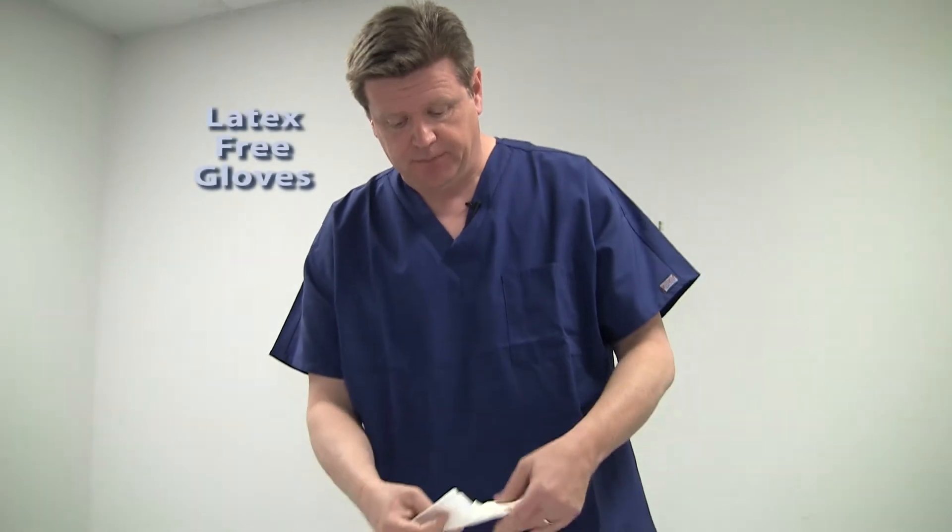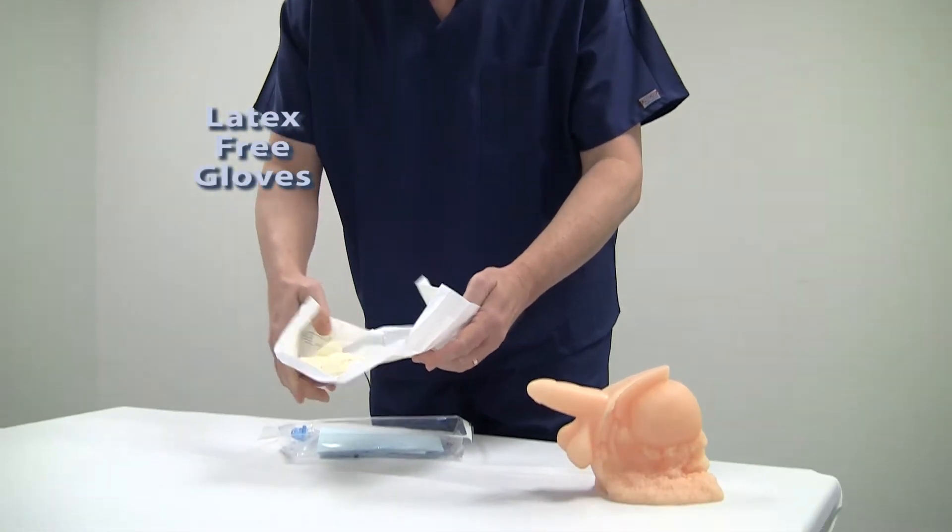First, I'm going to show a demonstration of how to catheterize the male patient. Before catheterizing, always wash your hands, explain the procedure to the patient, verify the French size, and ensure that the catheter tip is the correct variety. MTG EasyAdvancer catheter kits are packed in chronological order so that sterile catheterization is absolutely possible. We include cuffed folded latex free gloves, which we'll go ahead and don first.